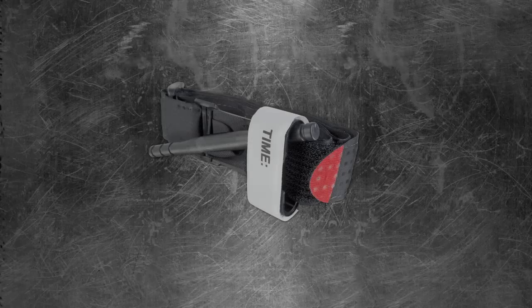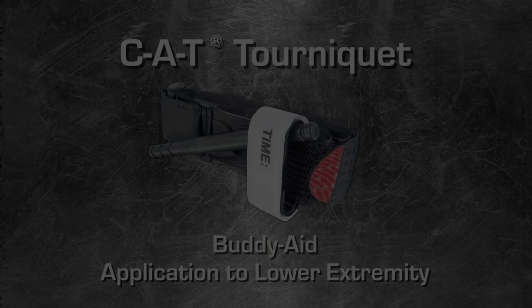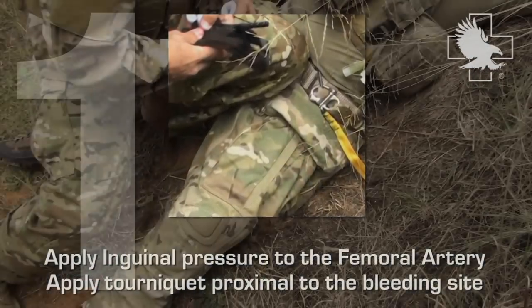Welcome to the CAT Tourniquet video tutorial: buddy aid application to lower extremity. Apply inguinal pressure to the femoral artery. Apply tourniquet proximal to the bleeding site.